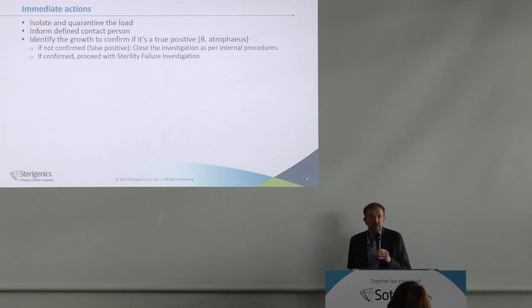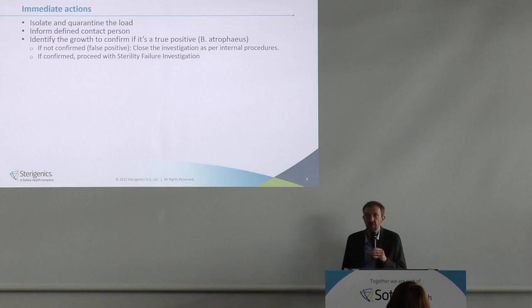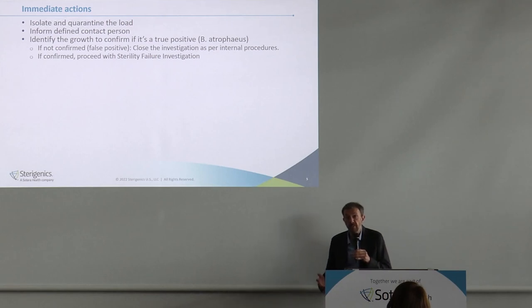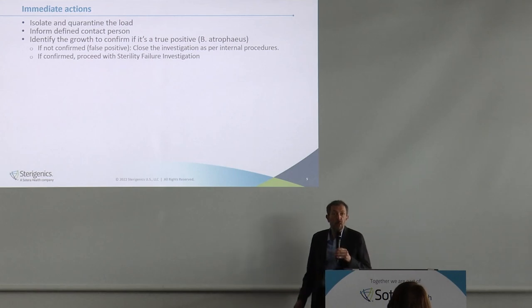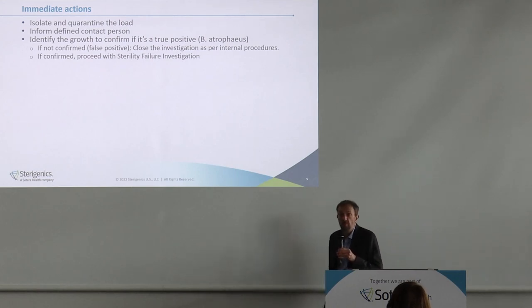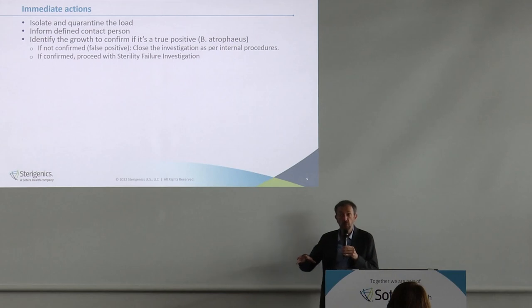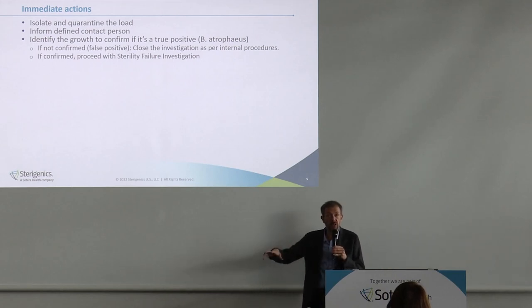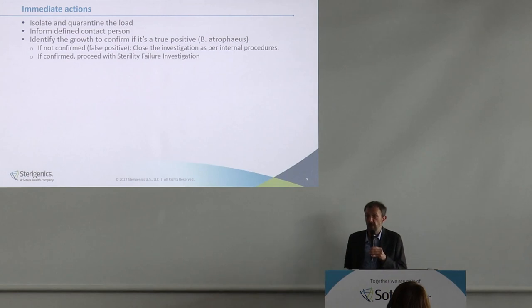The first basic step is making sure we have a true positive. We need to identify the growth obtained, and if we have a good likelihood that it is a true positive, then we can start investigation. If it's a false positive — lab contamination can happen; we are not always bulletproof — then we have internal procedures to deal with that. We explain it was an external contamination, invalidate the test results, and inform the customer that we had an issue but it has been resolved.